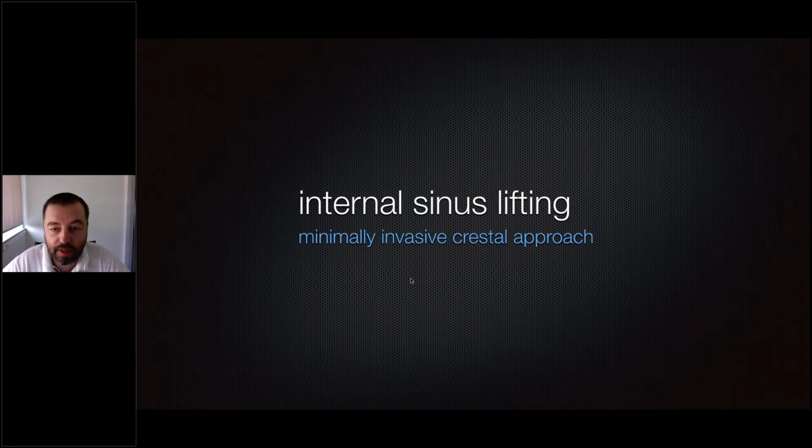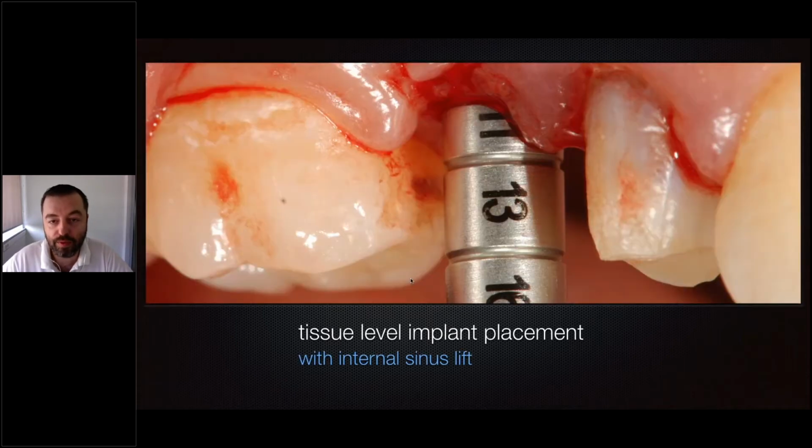The internal sinus lifting is something that can make a difference for the patient when compared to the external sinus lifting. We changed our limits: we started doing sinus lifting when we had 5-6 millimeters of residual bone. Now we are also doing this up to 4 millimeters and placing 8 millimeter implants.